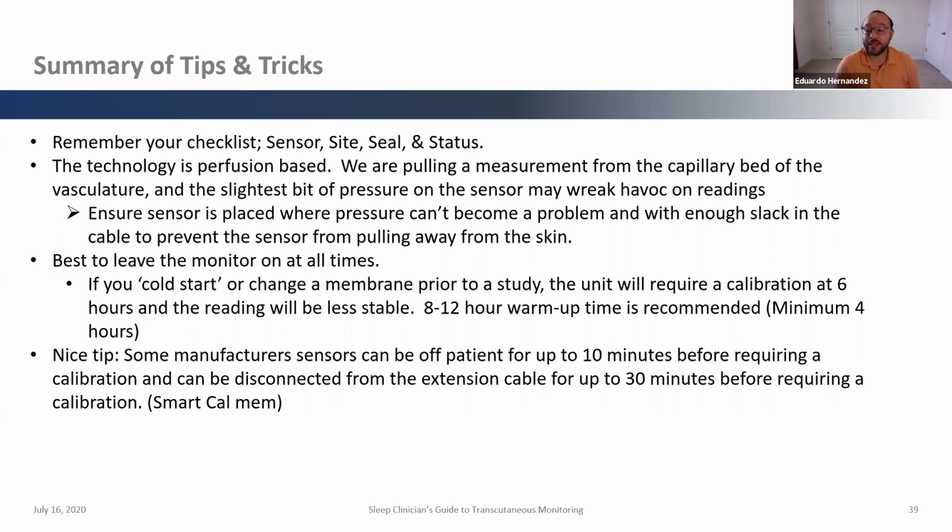So for example, if you have my preferred site for placing transcutaneous monitors, those sensors, if they're laying on their stomach in that prone position, pressure on that sensor will definitely alter the readings that you are reading. So you want to make sure, again, keep your patient in mind. If for some reason they're on their back and it's in their subclavicular area, they turn on their stomach, you'll probably have to change the site.